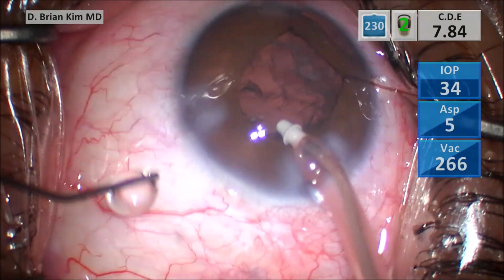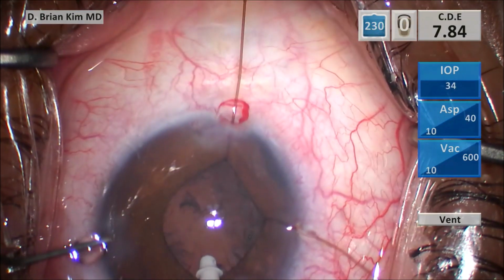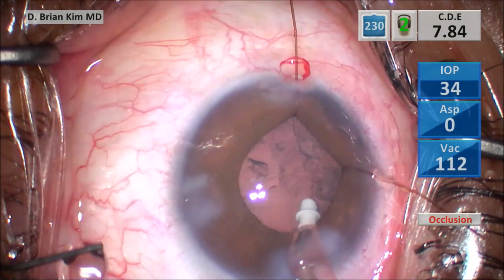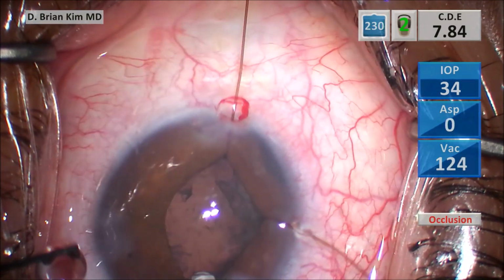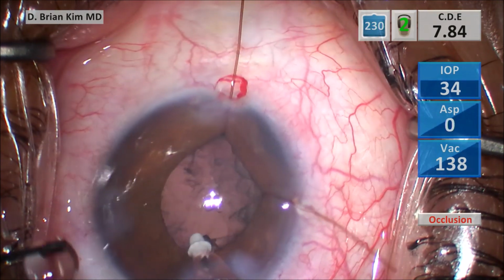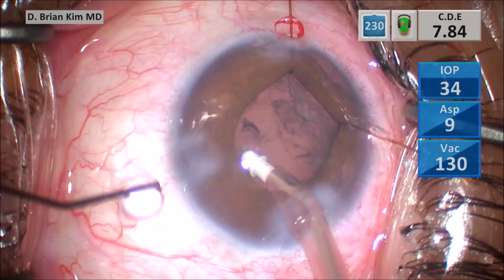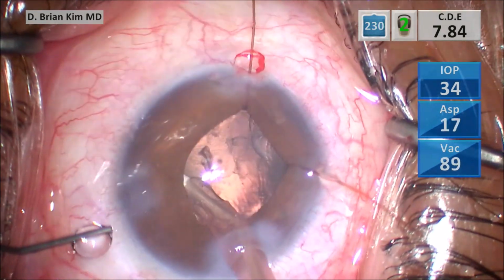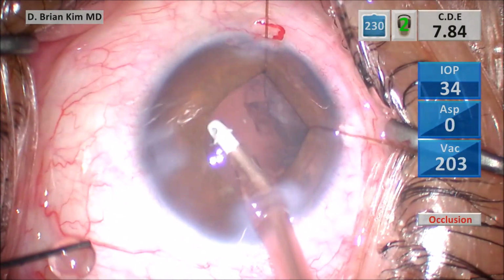But I switched to the IA, again, maintaining infusion with the BSS cannula, starting subincisionally, peeling from anterior to posterior, peeling the cortex in a clean manner, and staying away from the area of the iridodialysis until the very end. So you want to make sure you clean up all the cortex in all the areas that have healthy zonules, and you're going to go after the cortex in the area of the weak zonules at the very end.